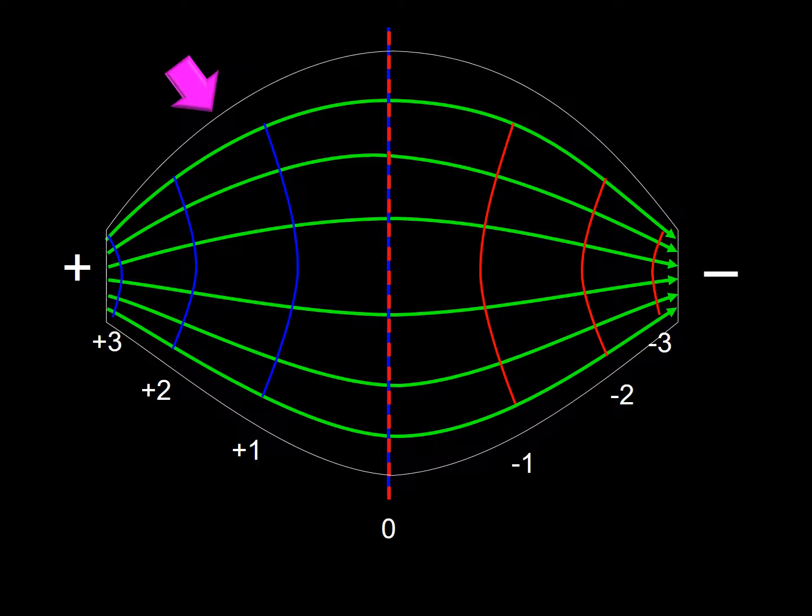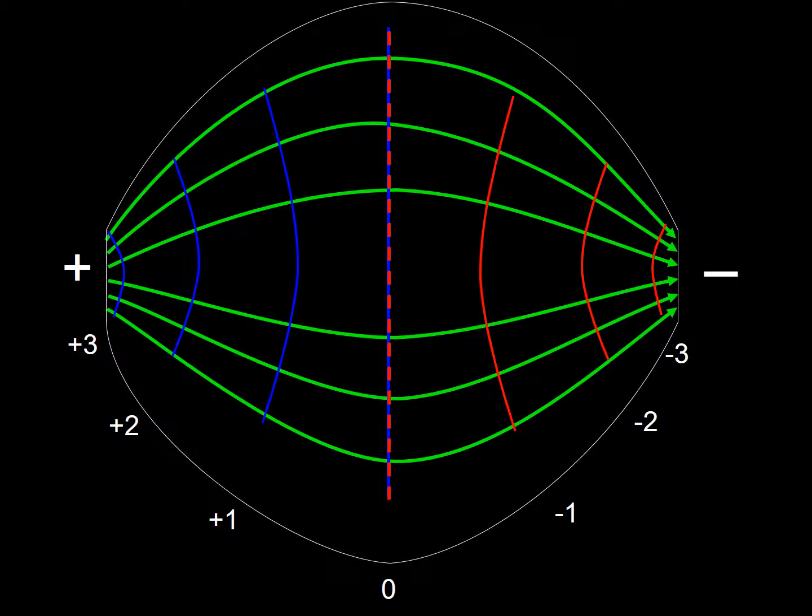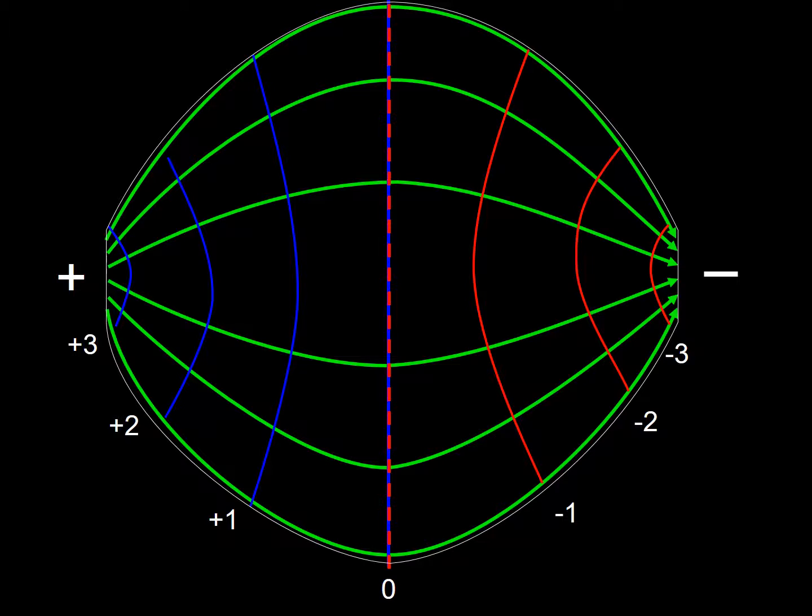Were we to increase the conductor even further, the current lines will adapt and the isopotential lines will change with them. And once again, were we to change the size of the conductors once more, the current lines as well as the isopotential lines will adjust to it. Notice that the midline isopotential line, the one red and blue, remains straight. And also consider that we have attempted to represent fictitious one or two-dimensional conductors. But in reality, in the body, we only have three-dimensional conductors. Thus, when we talk about conductors in neurology, we always talk about volume conductors because there are 3 dimensions to it.